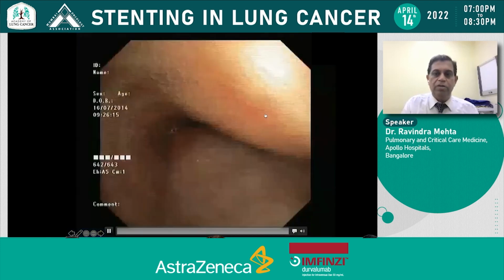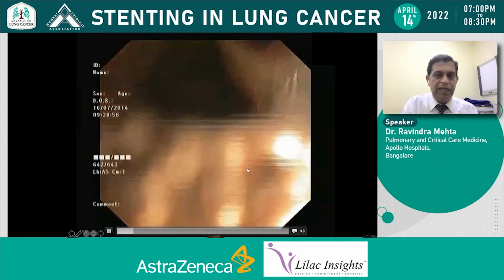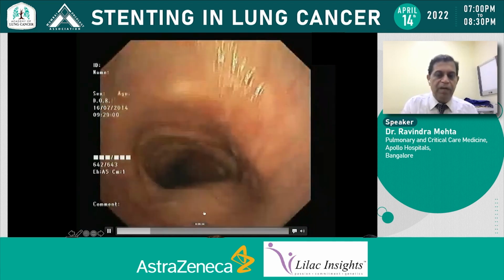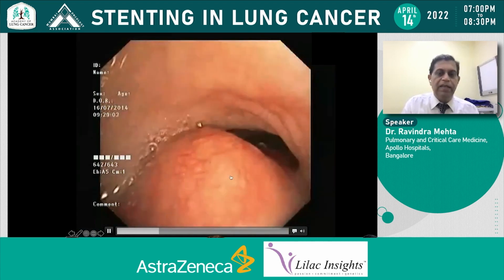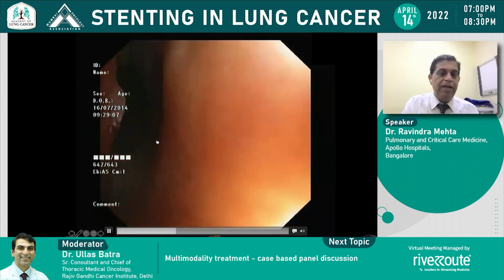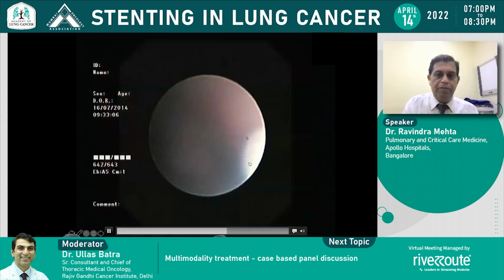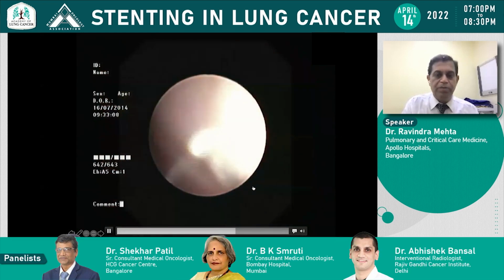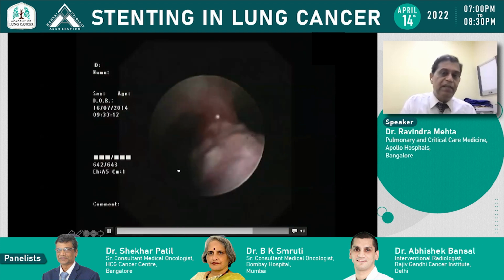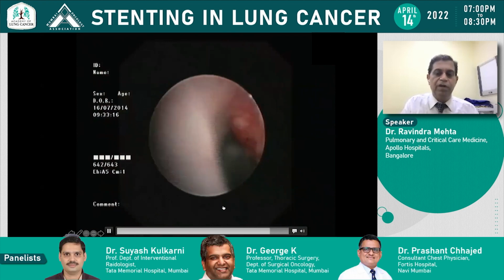A quick bronchoscopy gets done. You can see there is major trouble out here. This is the trachea. So again, to show you all over again, this is the vocal cord. The operator walking down cautiously. There is extrinsic compression, vascular compression. The operator tries to slide past over there to try and see the distal airways. The distal airways are full of pus because of post-obstructive infection. So we have a major issue out here, but the distal airways are open. And we will come back to this point later when we review literature.